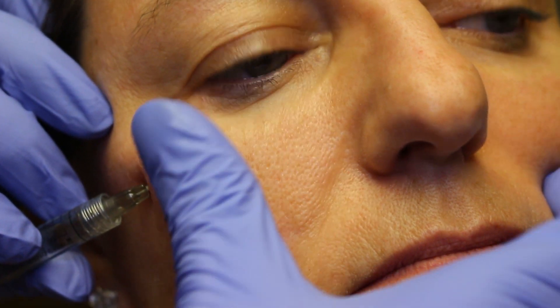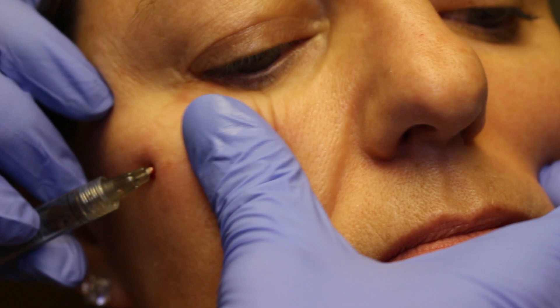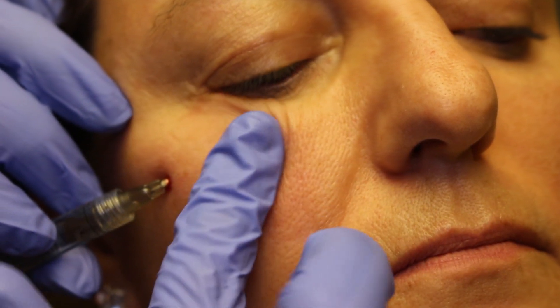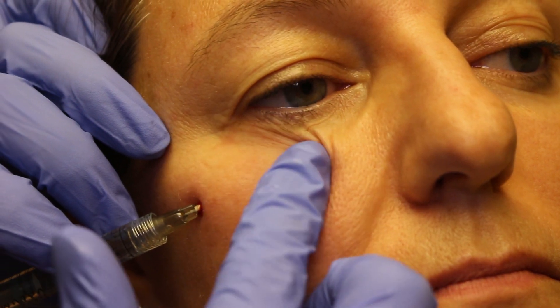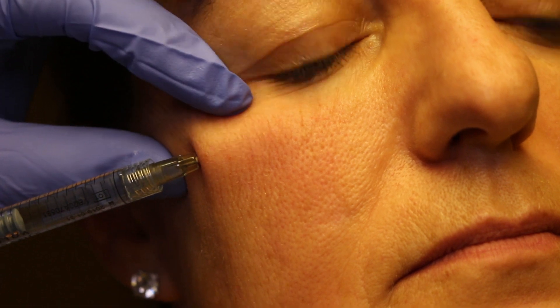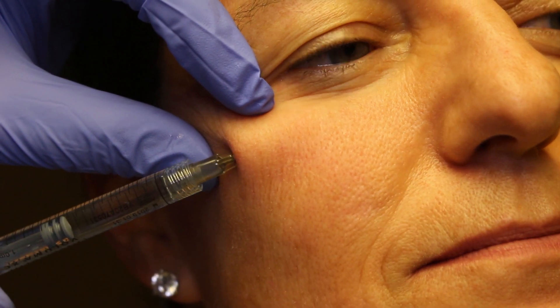Just put a little bit into the tear trough, just very slowly. What I love to do is you can use a cotton tip applicator — you can also just gently mold the product. So I'm just kind of working that in very delicately. It just feels weird as I pull on your cheek — doing okay? It should be fairly comfortable. And there we are.